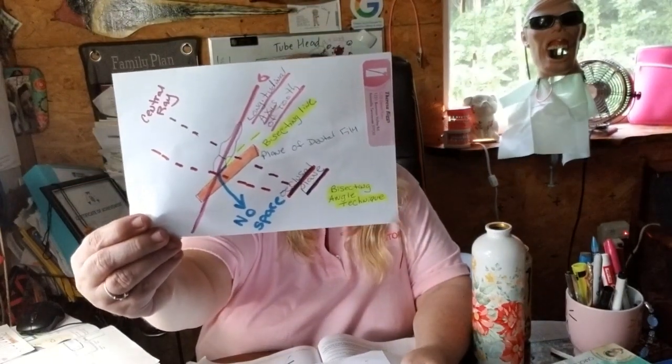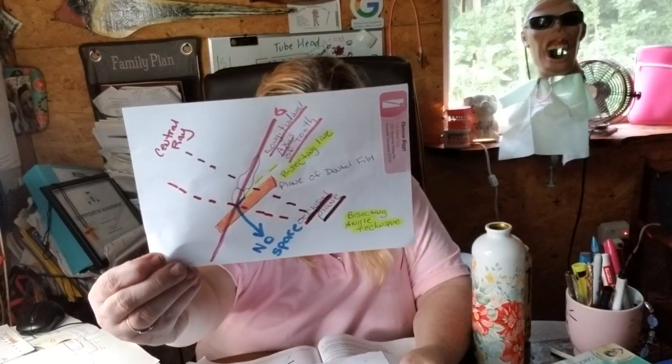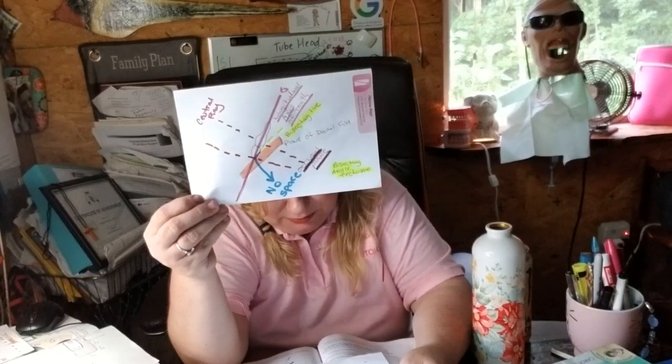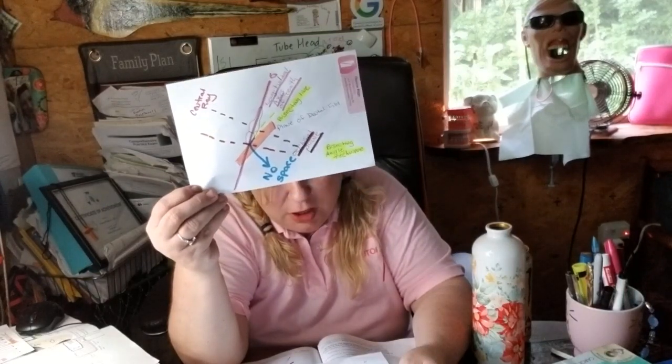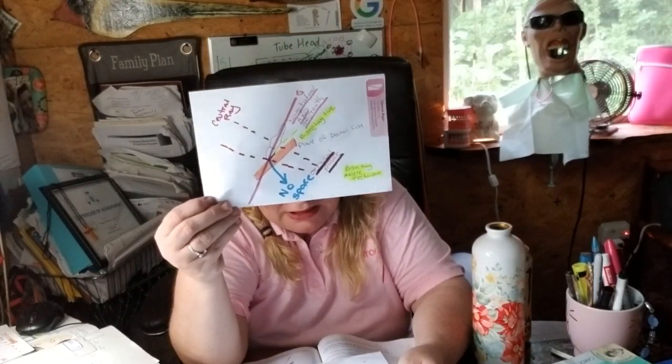The primary disadvantage of the bisecting angle technique when contrasted with the parallel technique is the dimensional distortion, okay? That is the primary disadvantage of the bisecting technique. For the maxillary premolar exposure, the front edge of the film should be aligned with the midline of the maxillary canine. They're going to be asking you questions on where to place the film, all right?